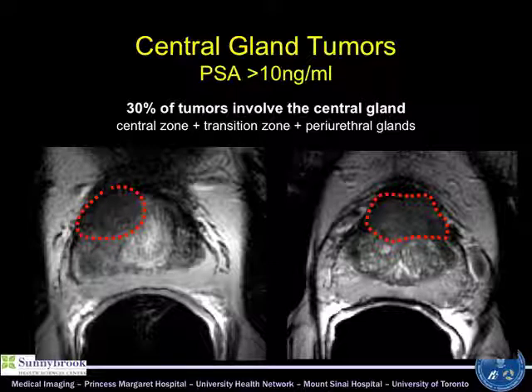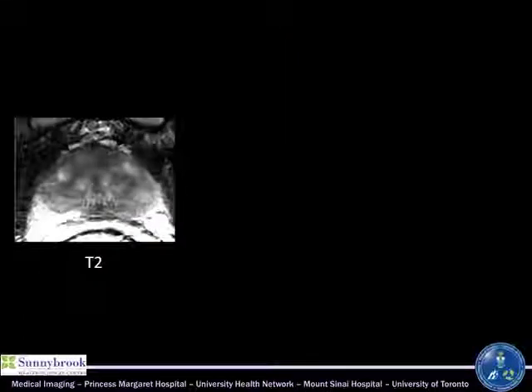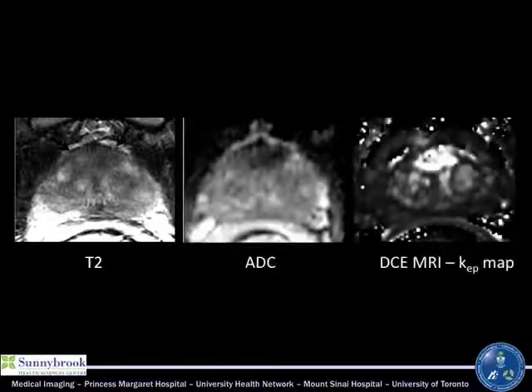I've had a few anecdotal TURP cases with these. It seems like in a significant number, again, it's anecdotal, so 2 or 3 patients where PSA is 40 and they've done a TURP, the cleavage for the TURP seems to sit just behind the tumor, and you look at the post-TURP MR and that tumor is still sitting there. So you don't always get it with a TURP. So I think the transperineal biopsy, if you're not a fan of imaging, and certainly with imaging we can hit these.